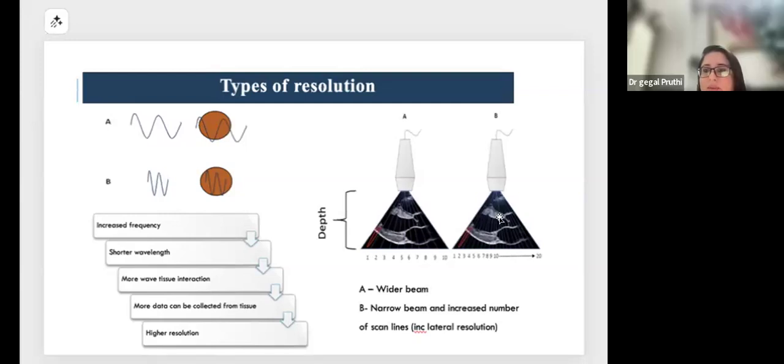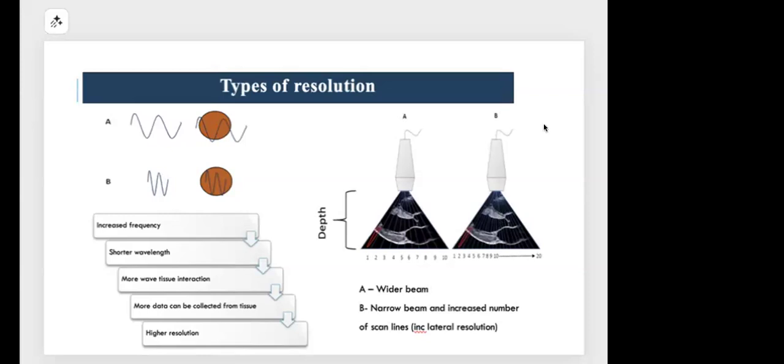Sorry, sir, I have to read about it. Do you have any idea about mechanical index, and how we can decrease this in case of bubble contrast study?